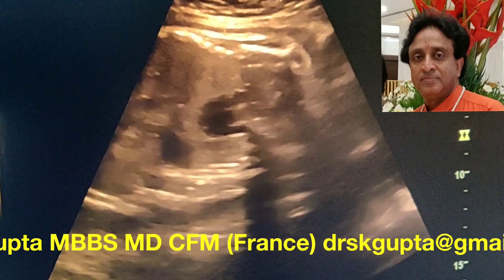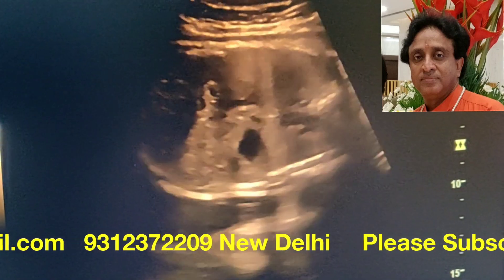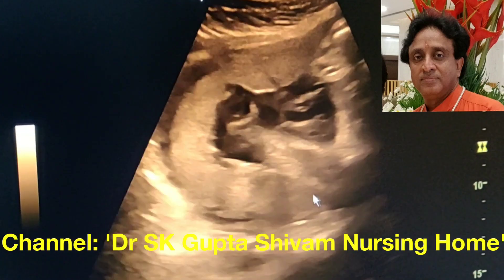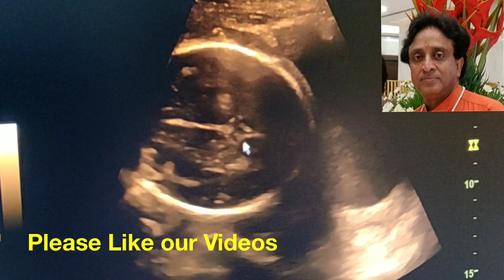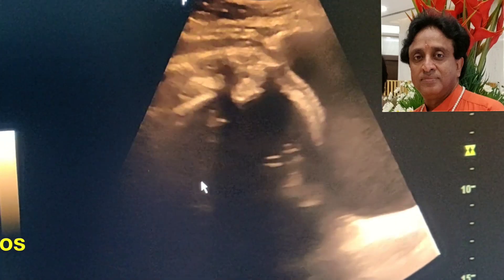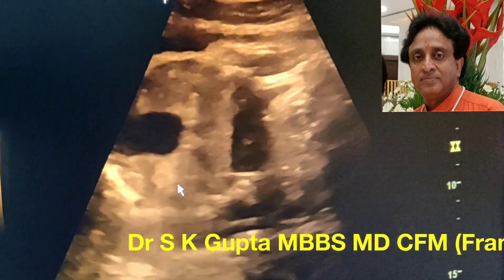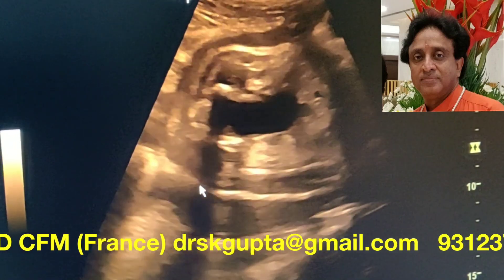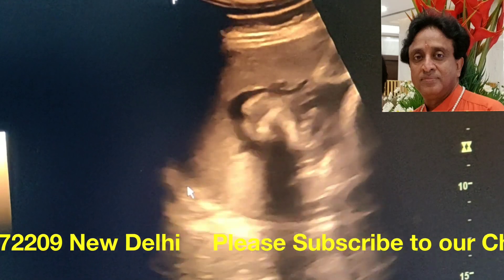This is a patient around 32 weeks of pregnancy who has come for an ultrasound examination. On the eyeball assessment alone you can see that the fluid in the abdomen and around various organs of this baby is pretty low. Those who have been doing ultrasound can assess by eyeball examination only that the fluid around the fetus is pretty low.